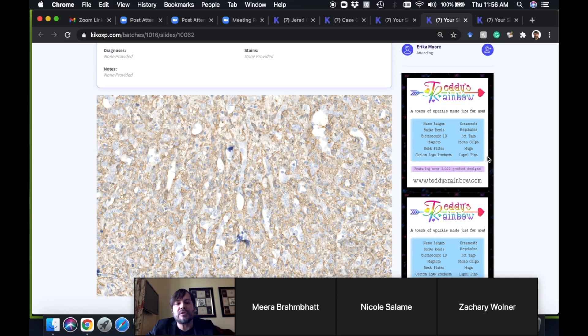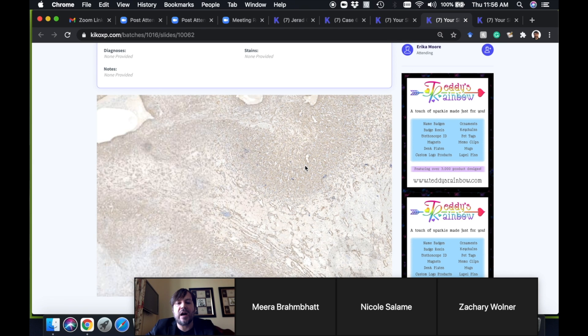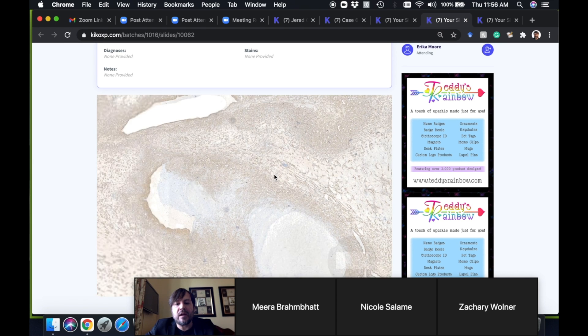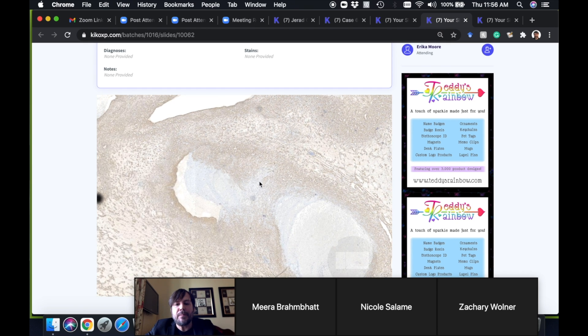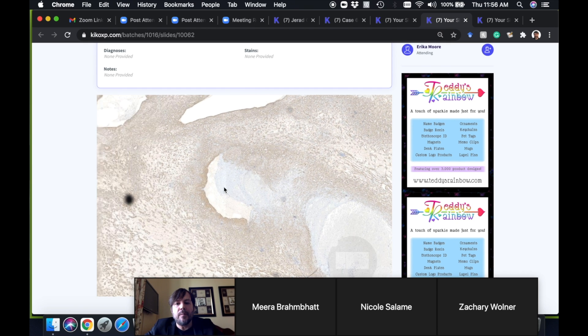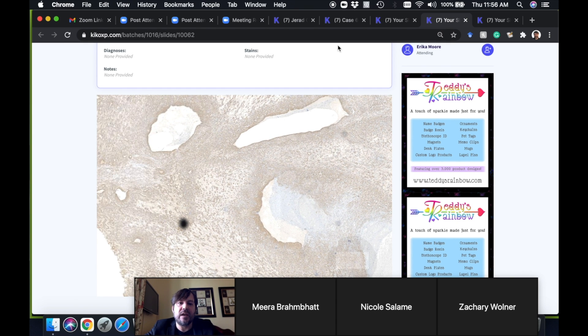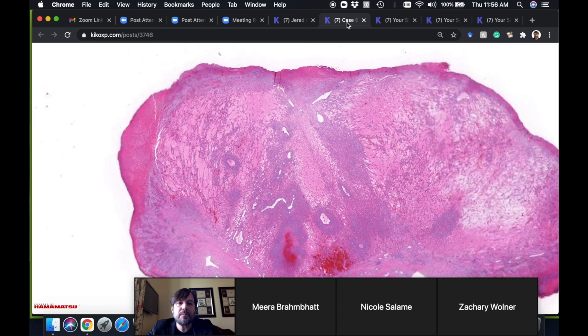Dr. Weiss taught me this trick about that: in cellular things you can use a vascular marker plus actin to kind of see which cells are pericytes and background myofibroblasts and which cells are endothelial. It does work sometimes, but I've definitely seen times where there were exceptions to the rule. It can help you out in a pinch when you're dealing with a challenging case and you need to get a better feel for the pattern. But here I just thought it was nice for teaching.